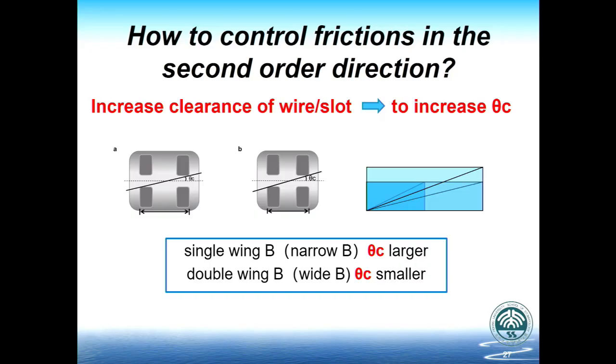each bracket system usually uses one slot size from the anterior teeth to the posterior teeth, right? You get only one slot size for the whole mouth, usually.